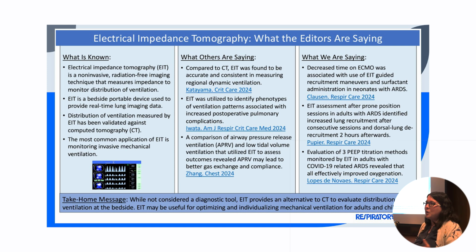I mean, it's not always that difficult. I think sometimes we make things scarier than they need to be, but it can be kind of scary. There's a lot of hands on board and we have to talk about it a lot. I'm not saying it's impossible, and it's definitely something I work with my team on. But the thing with EIT is that it is a non-invasive, radiation-free imaging technique that looks at ventilation and distribution at the bedside. You don't have to take the patient out of the room. So that is a huge benefit.